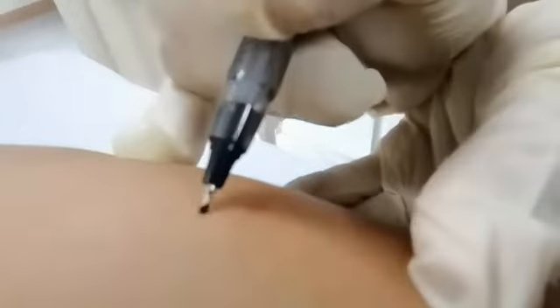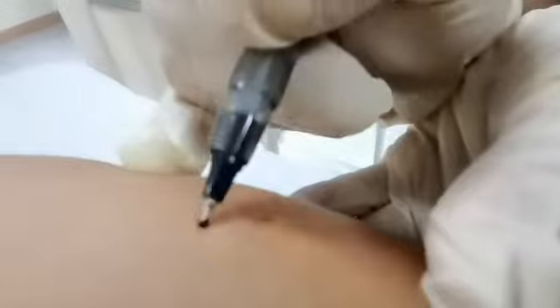This is a raised welt that forms on the arm. The bleb should be present. Remove at same angle that was inserted. Gently remove blood, if any, by dabbing with second alcohol swab. Observe skin for redness or swelling.